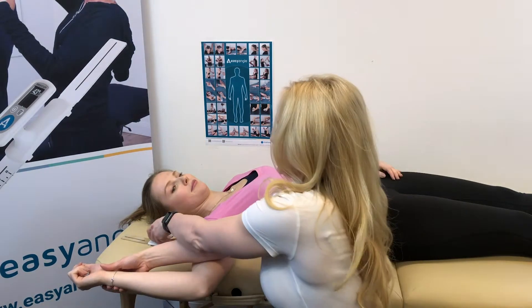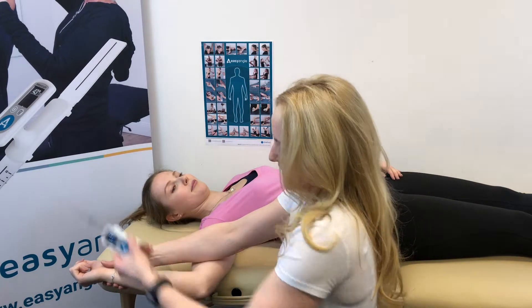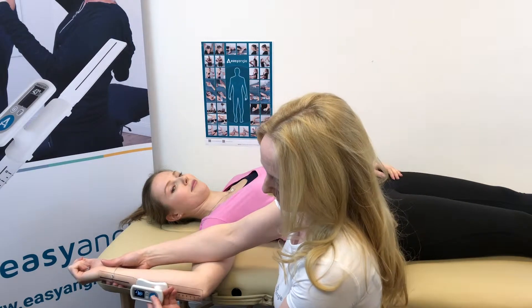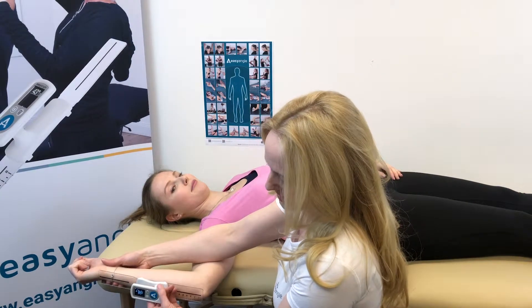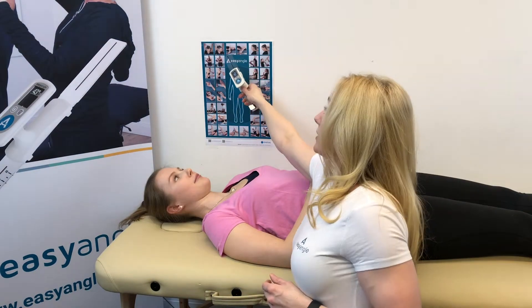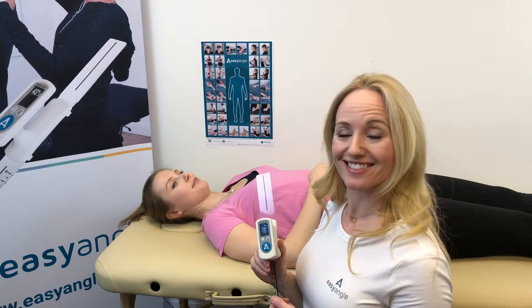We then take the device back again, press the button, and we get our measurement. This is the measurement demonstrated on the middle of the top of our measurement poster.